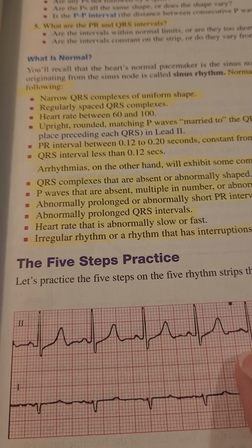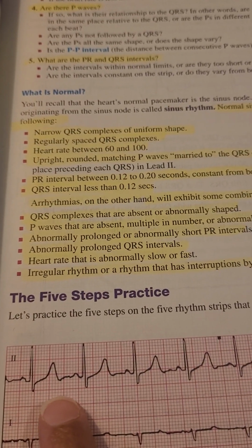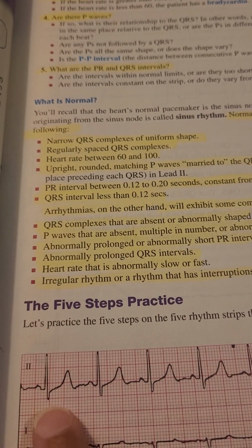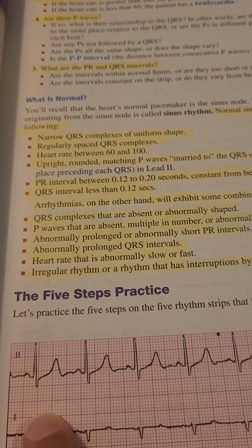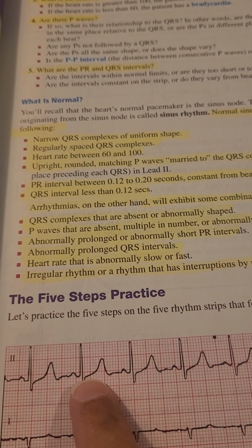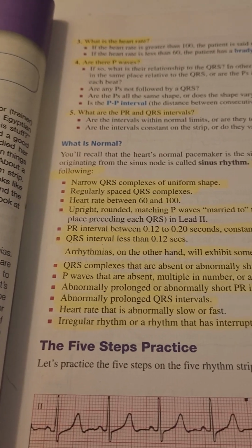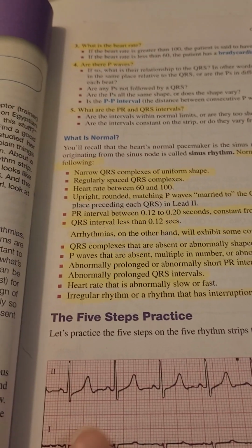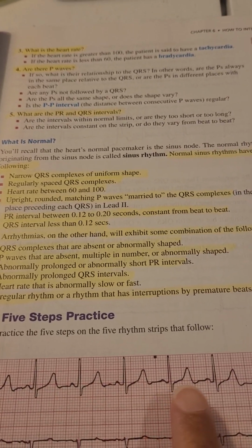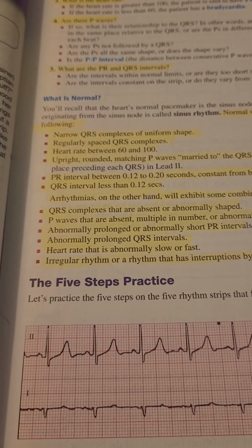Are there QRSs? There should be QRSs in every marching beat. They should be thin or narrow. They should have, like they said, the uniform shape, which is P, Q, R, S, that goes up and then down, and then the T wave. That's what the normal uniform shape looks like. Regular spaced QRS complexes: it should be spaced out the same, very neat, very pretty. That's what a normal heart rate is, right?